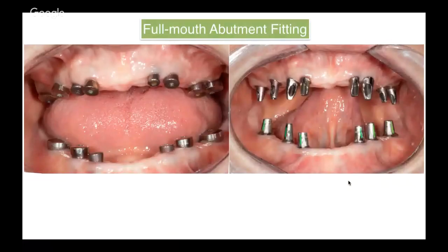In a full mouth try-in, we spend minutes to adjust the abutment to sit as it was on the model. To be honest, as a prosthodontist, the perfect geometric shape is the least polygonal shape, trigonal or tetragonal, but not dodecagon or double hexagon. Please think about it later in the future when you choose an implant system.